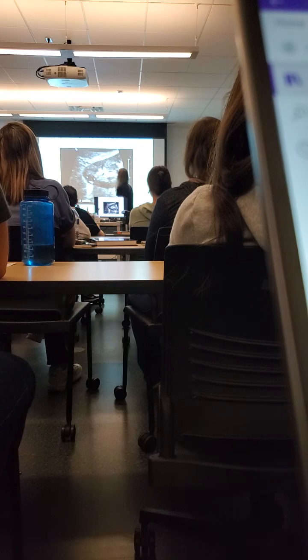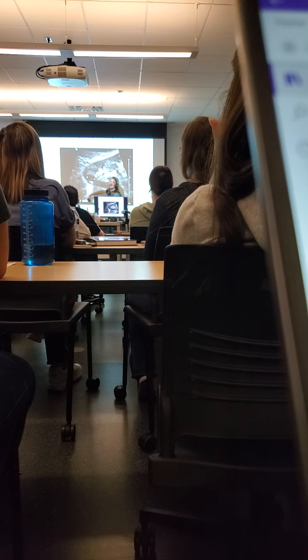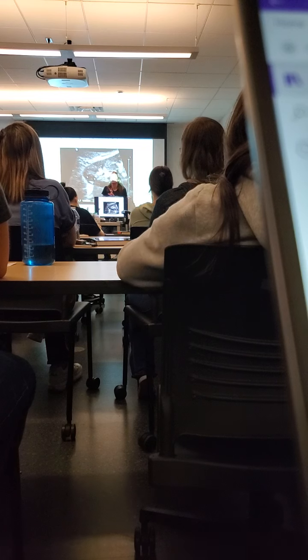And here, remember we talked about that enhancement, so that beam is actually preserved and gets a little bit brighter as it goes through the structure. So in this case, we have kidney cortex here. And see, we have this little strip of bright. So our beam is going in here, and what we call attenuating is kind of getting lower and lower volume as it goes. But in here, the volume went up, so the amplitude increased. And so this little cystic area doesn't have any beam bouncing back, so it does what's called enhancing. So it's kind of the opposite of shadowing.